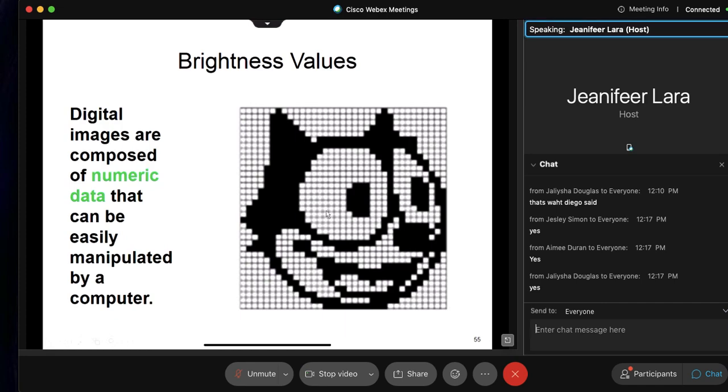But what about right here, Amy? What happened in these pixels? It's high brightness. And what kind of numerical value was provided there? I'm just thinking about the 0, 1 that zero you said. It's just 0. Now, 0, 1 is going to be binary talk. We're going to get there. It's just 0. So if our kVp was 100, you could probably say the value here was about 100 and right here was 0.